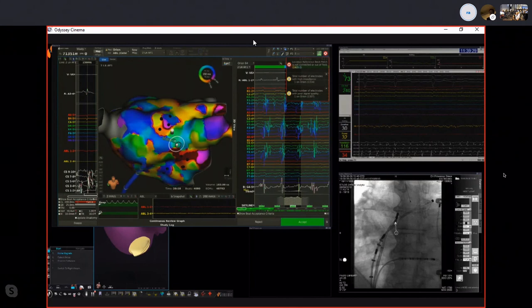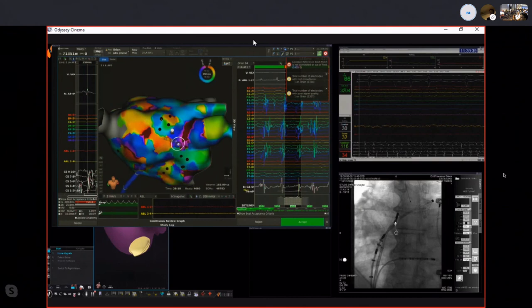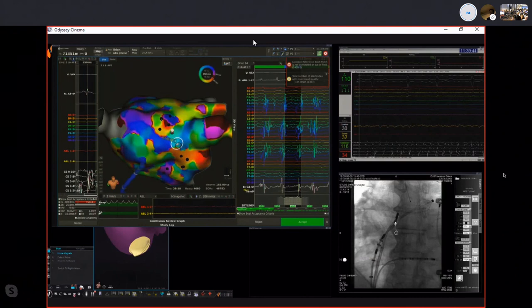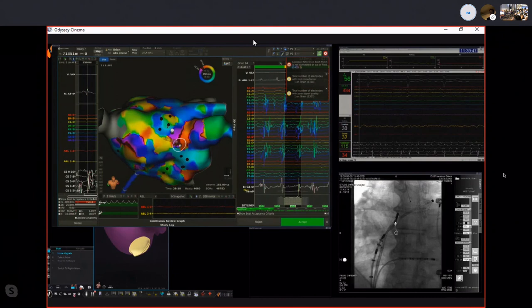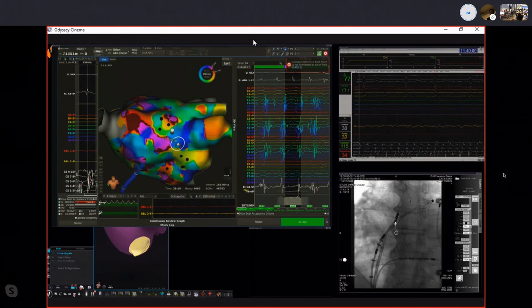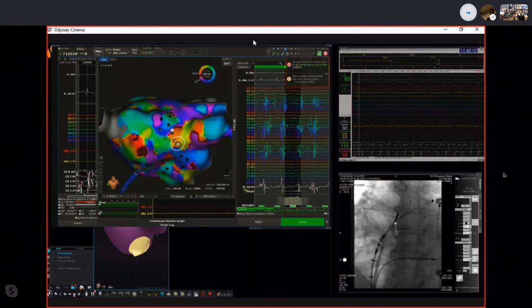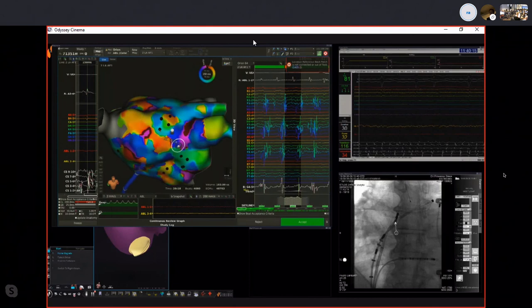Now, you can also see on the map some black tags. So this corresponds to what we visually annotated as fragmented potentials, just in the common accepted sense of visual fragmentation while mapping. And actually, we use them for rotation as a pinpoint to show us that we might find something interesting in that area. And you can appreciate that they are a little bit displaced with respect to what we really find on the activation mapping. At least these two ones are completely due to collision, mostly when you look at the activation mapping and not to a pure local driver.